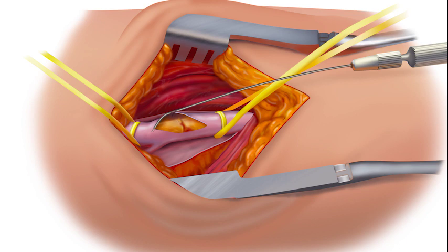Percutaneous access for EVAR can be obtained in over 90% of patients and is successful in more than 95% of cases. Advantages of the percutaneous approach include shorter procedure times, fewer wound complications, and less postoperative pain. The main disadvantage of percutaneous access is that a small number of cases may need to be urgently converted to open repair.